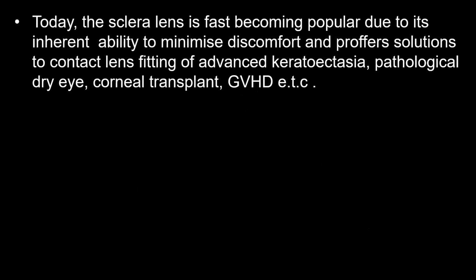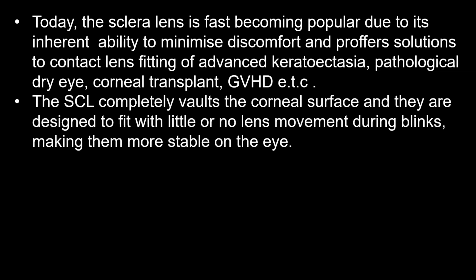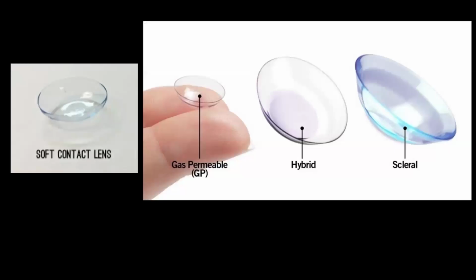Today, the scleral lens is fast becoming popular due to its inherent ability to maximize comfort and provide a solution to contact lens fitting of advanced keratoectasia, pathological dry eye, corneal transplant, and graft versus host disease. So now, what are these scleral contact lenses?